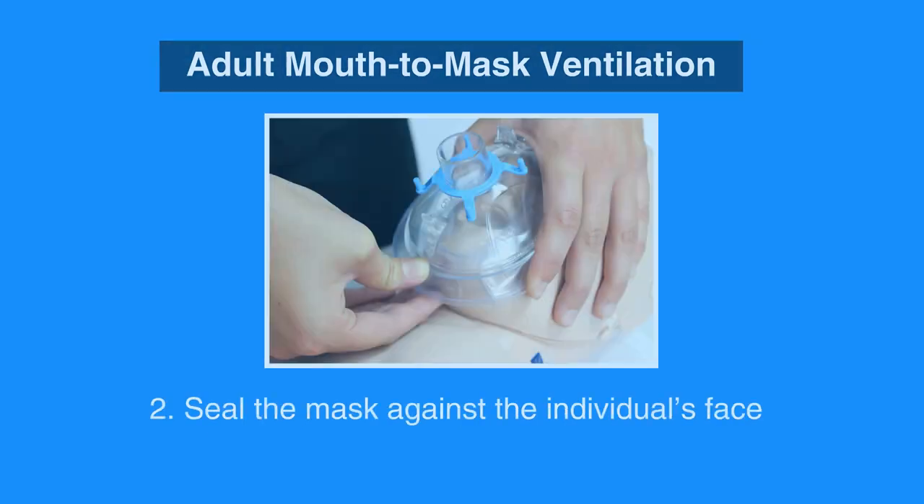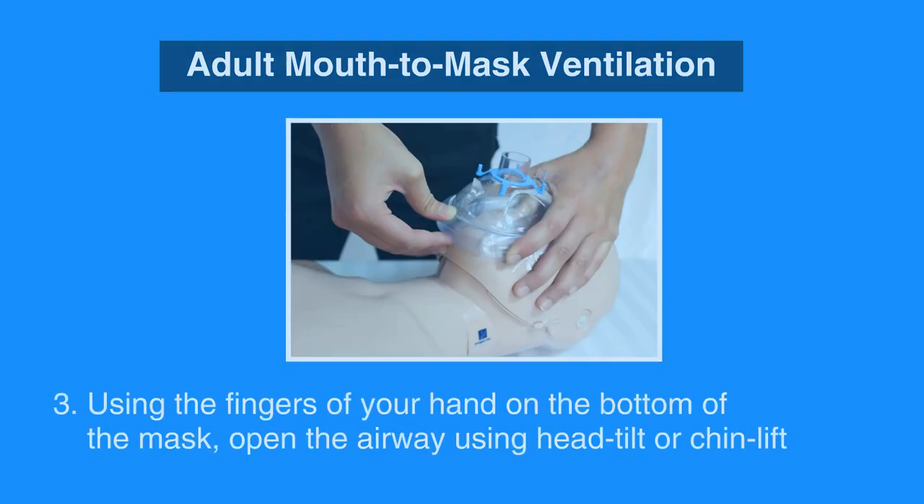Next, seal the mask against the individual's face by placing four fingers of one hand across the top of the mask and place the thumb of the other hand along the bottom edge of the mask. Using the fingers of your hand on the bottom of the mask, open the airway using the head-tilt-chin-lift maneuver, unless you suspect the individual may have a spine injury.